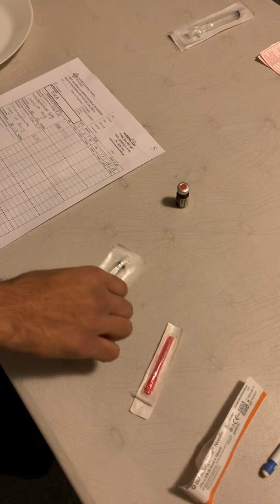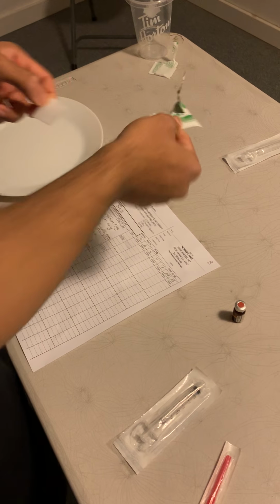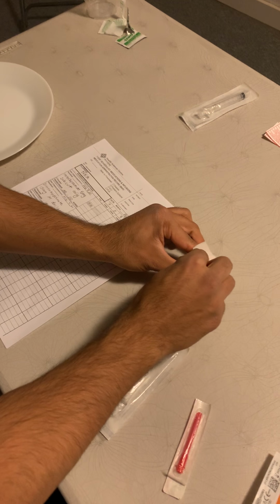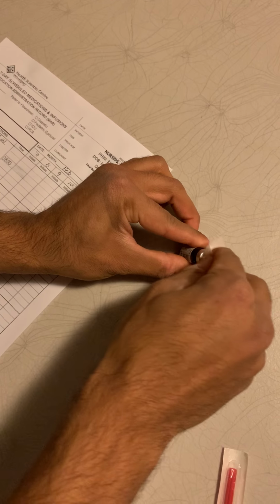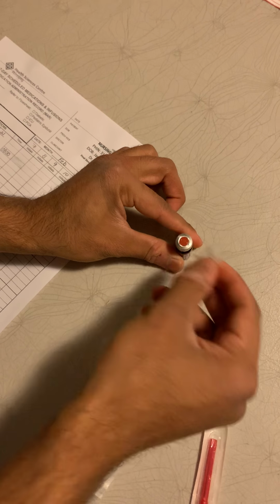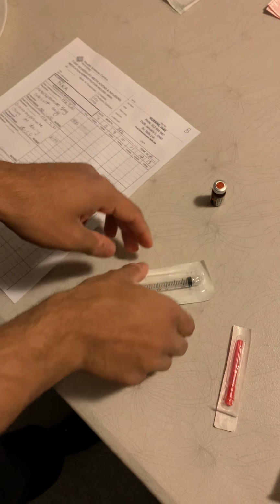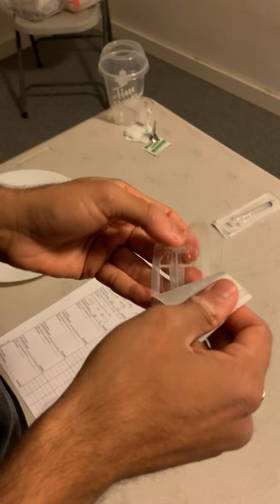First thing we're doing is hand hygiene, getting an alcohol swab, and wiping the top of the vial for 30 seconds in a circular motion. I would be doing this for 30 seconds in a clinical setting, but right now let's just say it's been 30 seconds of cleaning. Second thing we're doing is getting my syringe.